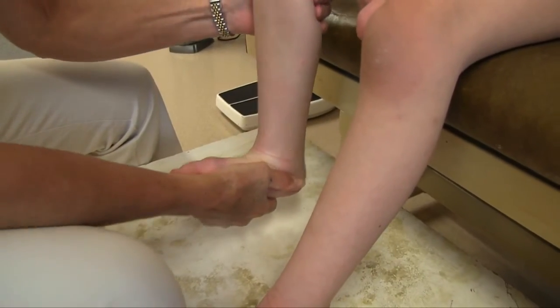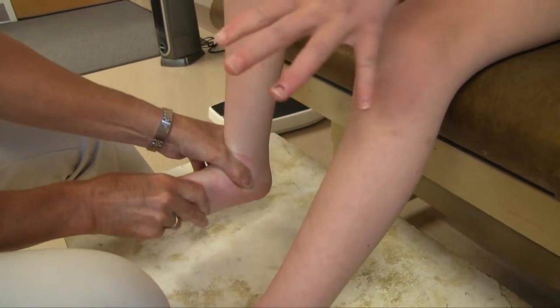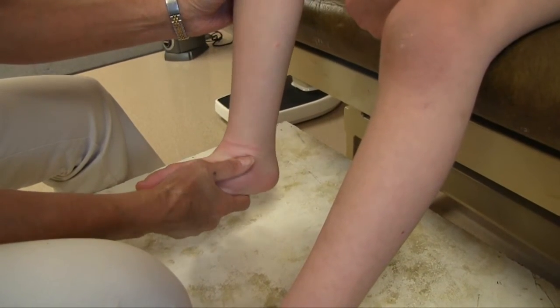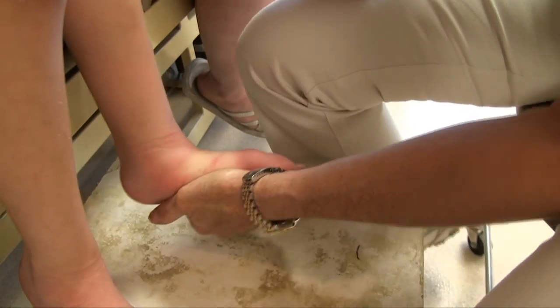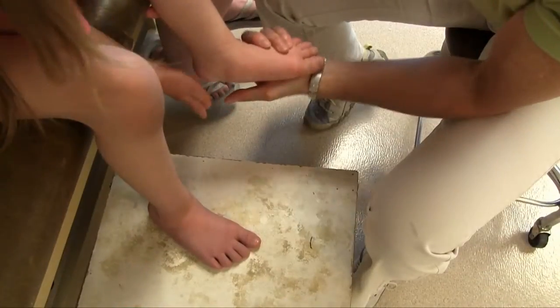In passively ranging her, her extension tone is difficult to break, but once her knee is flexed, we can actually get normally about five to eight degrees of dorsiflexion. She's got good hind foot range of motion. Her left foot, on the other hand, is much tighter. She has a lot more extension tone. It's very difficult to break that tone, even though she's being stretched on a regular basis by her mom.